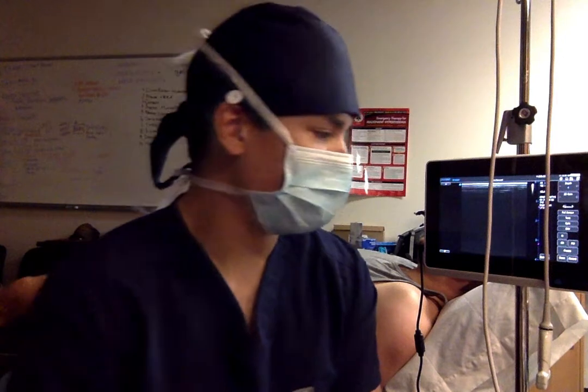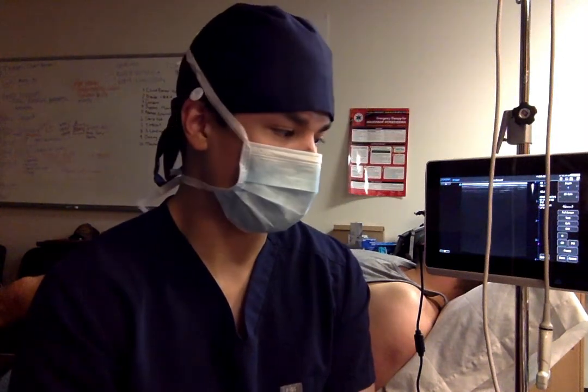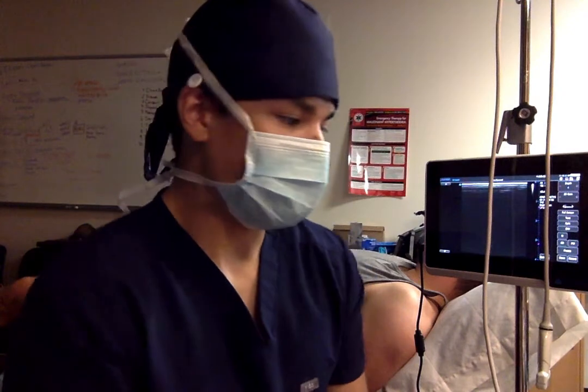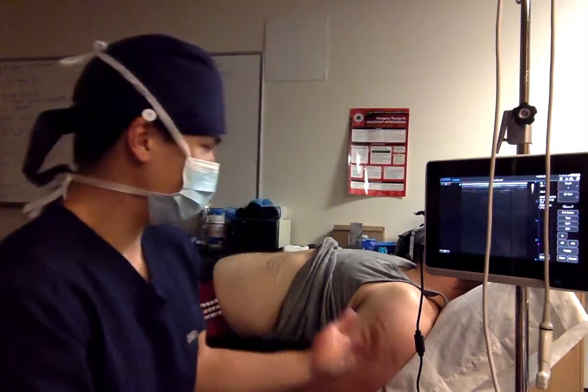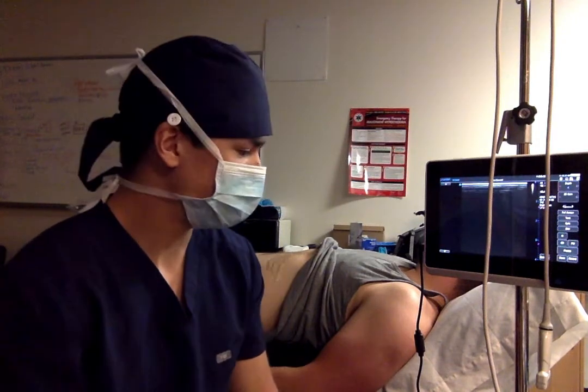And then we're going to give my induction meds or sedation meds. Right now I'm just going to do sedation, so this is going to be 2 milligrams of Versed, 30 milligrams of ketamine. And so then I'm going to position my patient. They're going to be in a supine position. They're going to be induced already.